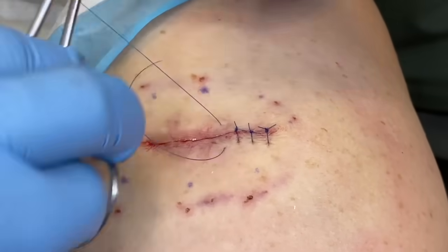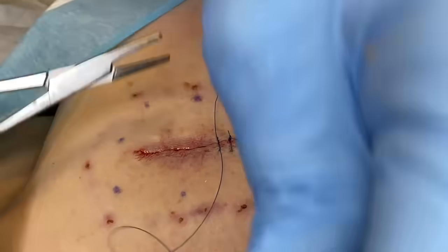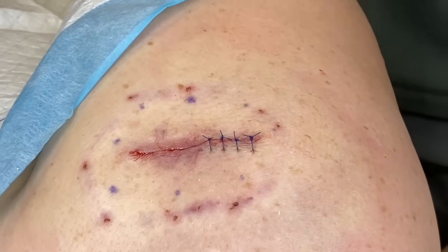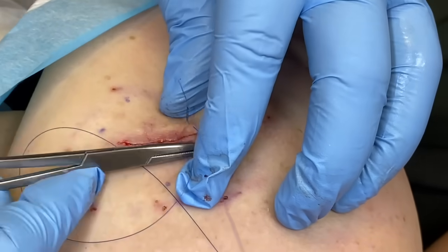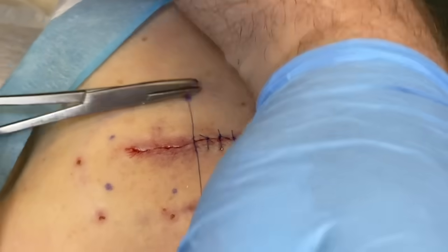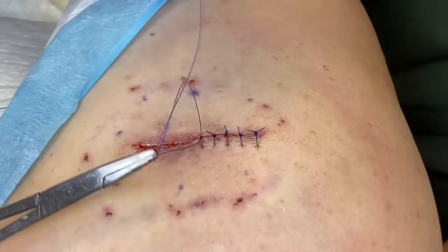So here's my V, 3 loops. Hold this just so I'm not losing so much thread. Hold that flat, and that should lay just like that. I'll do this one and the next one, then I'll let you do the rest. Do you want to get another cartridge, Rada?